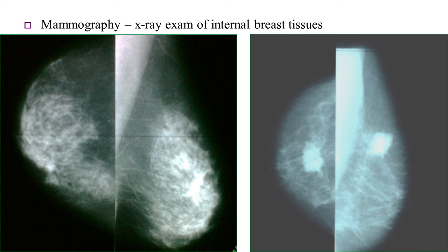So another study you have to know is mammography. Mammography is a very common study. We have a very good machine in our hospital here, and we do screening, we do everything with this machine. So we use mammography in patients more than 40 years. It is very important to know. We request a mammography in patients who are more than 40 years.